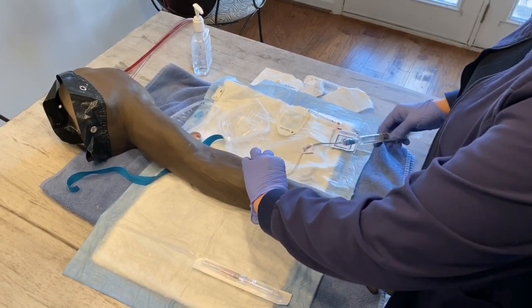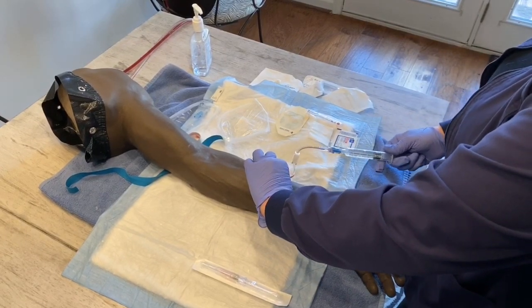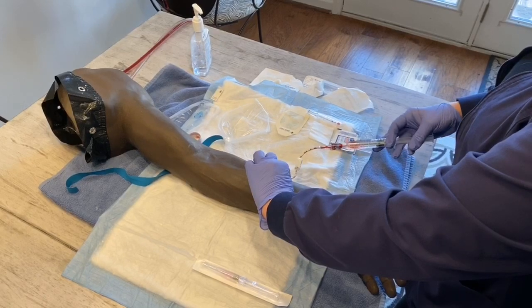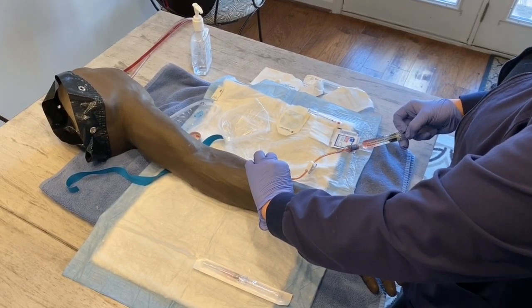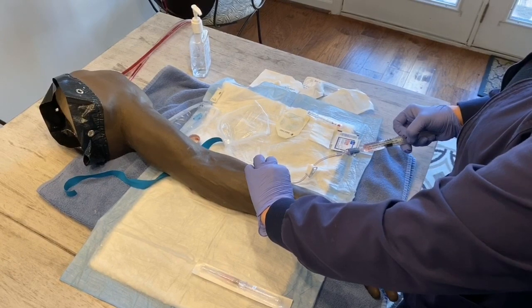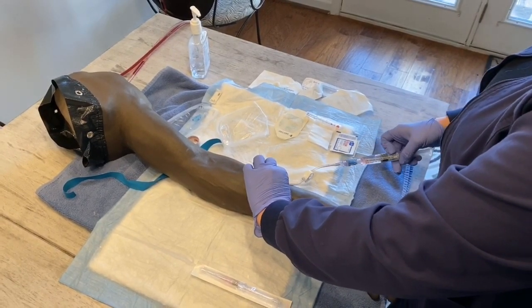Now, before I go any further, I like to pull back just slightly to see if I'm in the vein. If I get a blood back into the site, that's perfect. But if you don't, worry. It doesn't mean that you're not in the vein. Then go ahead and flush the site with 2 to 3 milliliters of solution, looking to see if there's any infiltration, and there's not.